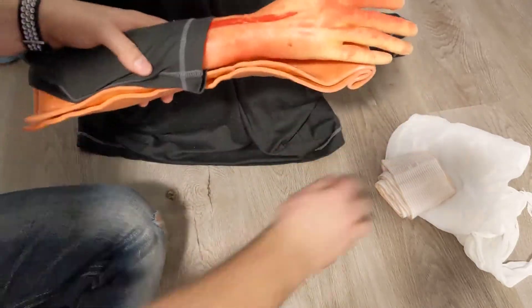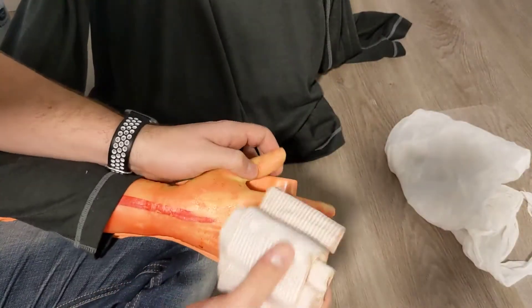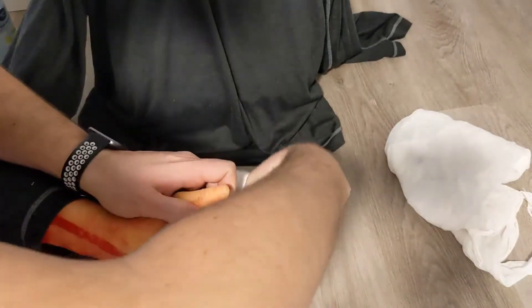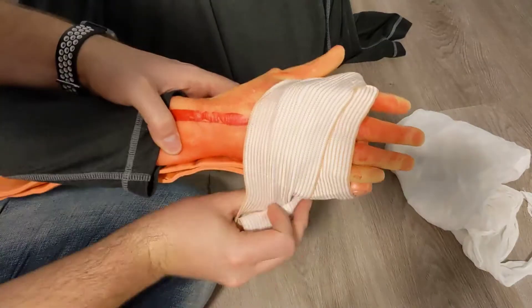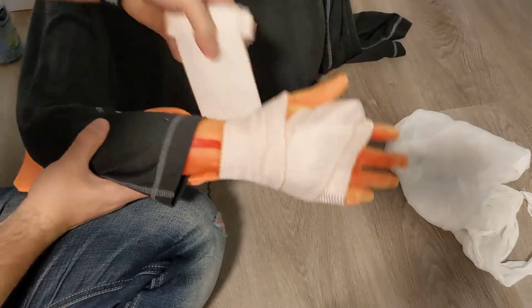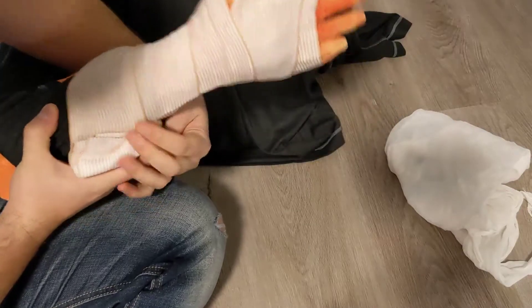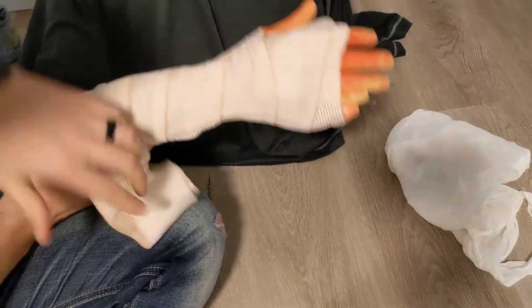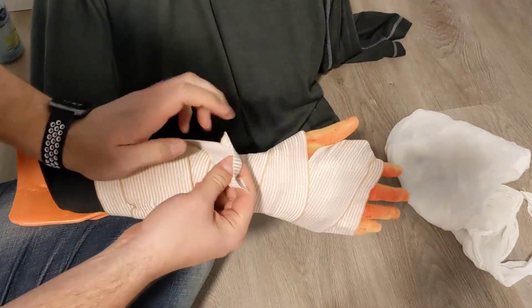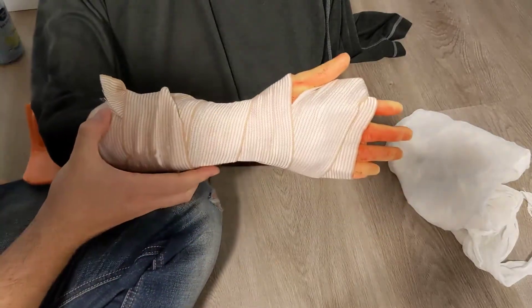To secure the splint, elastic wraps work really well. A key thing with wrist splinting is getting below the thumb — starting there really anchors it on. If you miss that, the splint tends to slide. Then just keep the wrap snug but not too tight, and wrap it up to secure the splint. At the end you can use the clips if you still have them, or simply tuck it — that works well to keep it on.